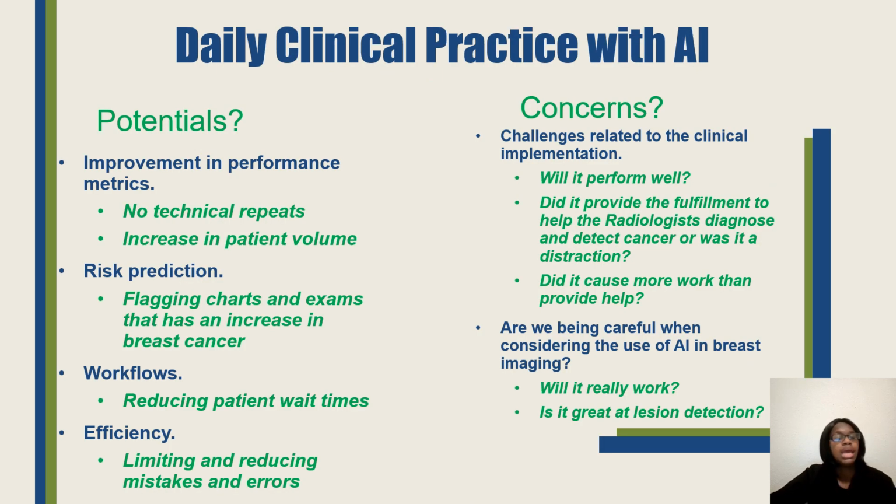Okay, so we'll start with the potentials. With the help of AI, technologists and radiologists can improve performance. As a technologist in the mammography department, in the radiology field, it can help us avoid positioning errors and minimize how many times we have to call a patient back because of technical repeats. It can help flag risks, help with workflow, reduce patient wait times, and reduce mistakes and errors.